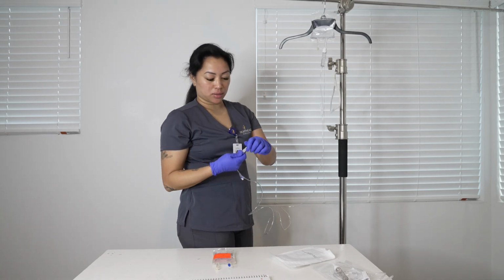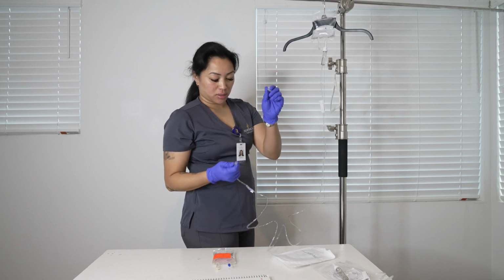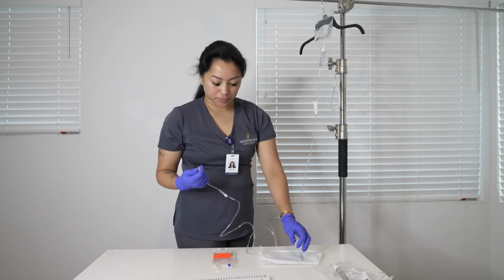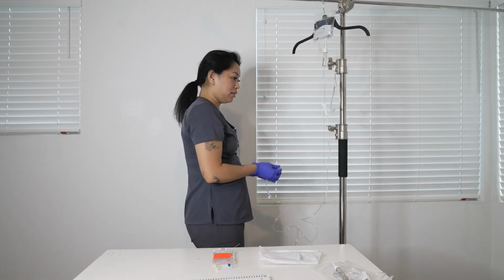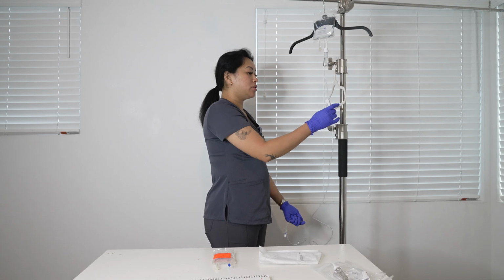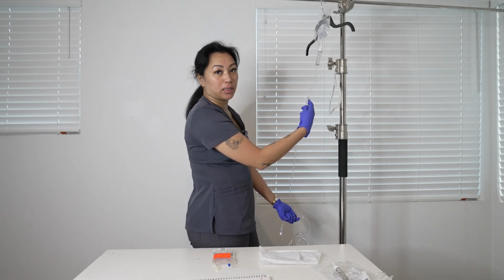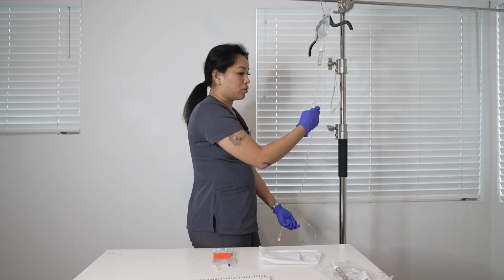So now I am going to unclamp, undo this cap for the adapter, put that aside. So now I'm going to prime the tubing and let any air bubbles out. So now I'm going to slowly unclamp the roller clamp.